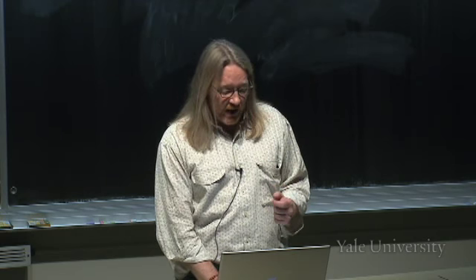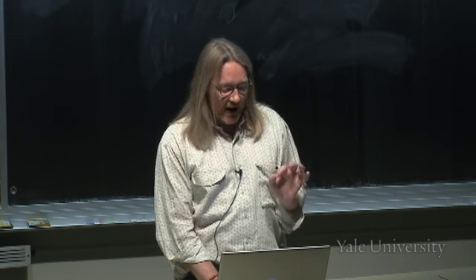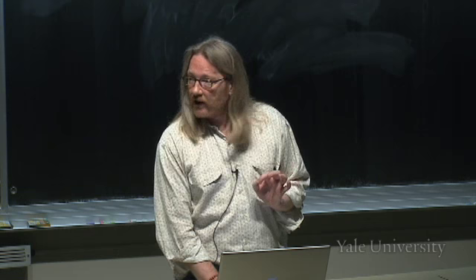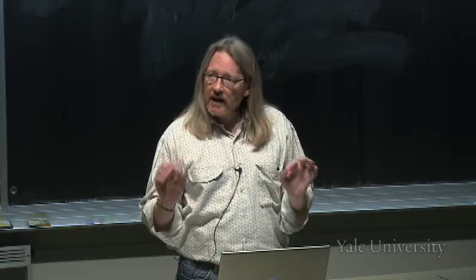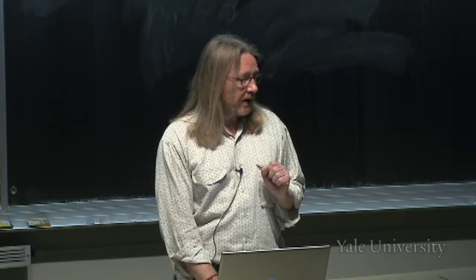And what you see is that under the mixed condition, when they're hearing both Spanish and English, there's a certain portion of the brain that's more active than it is with only Spanish and only English. And from this, you could conclude that this part of the brain must be involved somehow in the special activity that was happening at this point here. That is some kind of a mixed language experience.